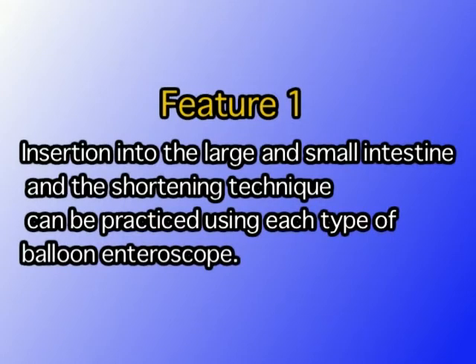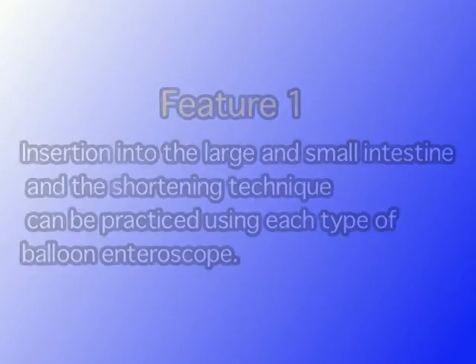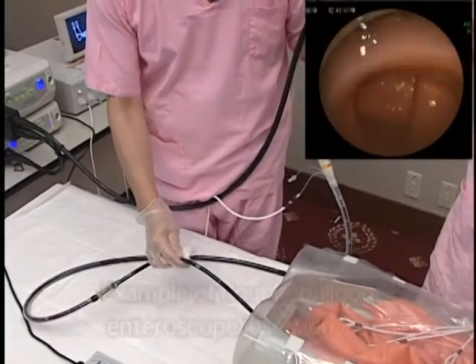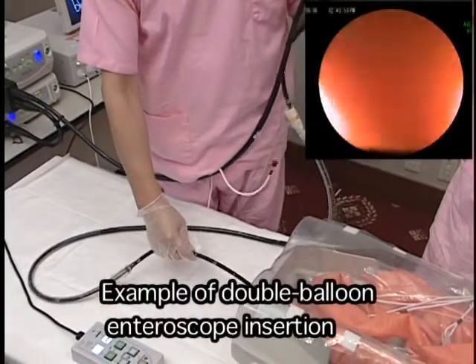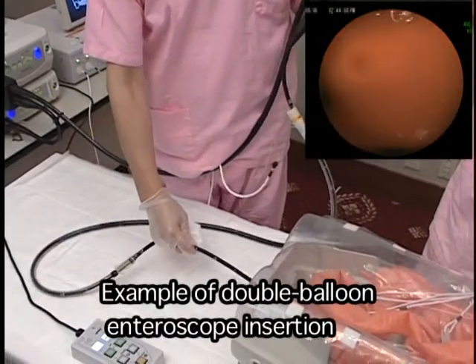Feature 1: Insertion into the large and small intestine and the shortening technique can be practiced using each type of balloon enteroscope. This is an example of double balloon enteroscope insertion.